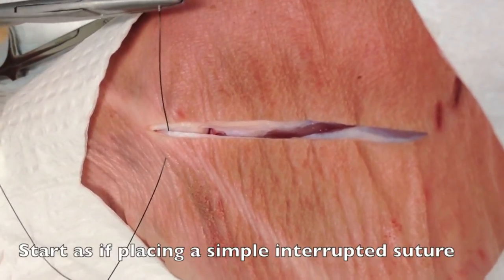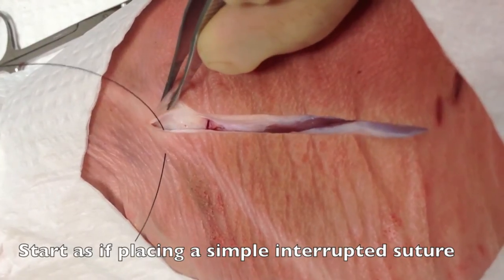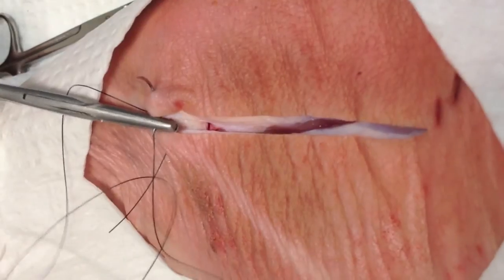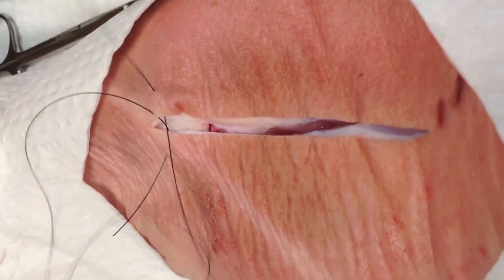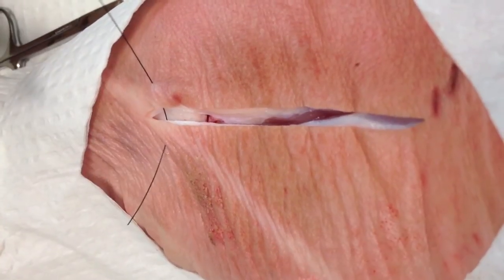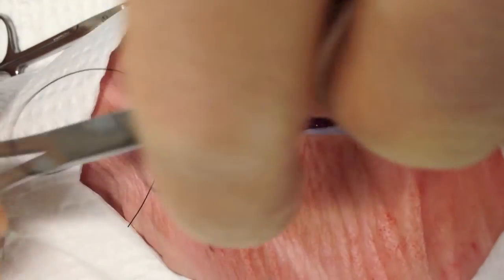The first step of this type of closure is to start as if you're placing a simple interrupted suture at one end of the wound. You're going to go ahead and close this with simple instrument ties the same way you would a simple interrupted suture.